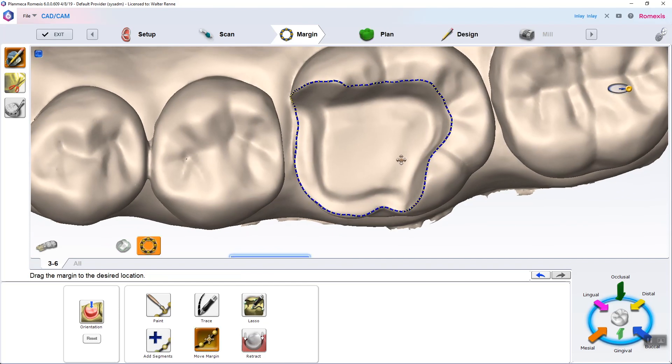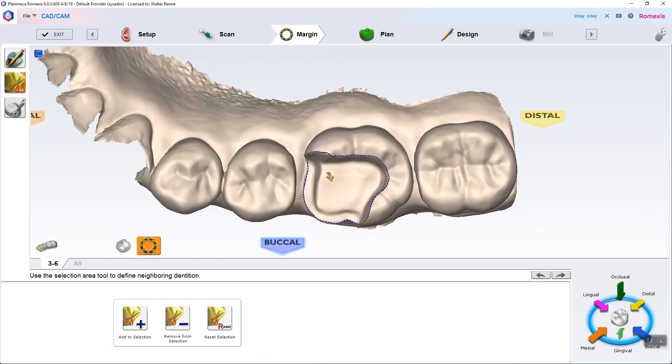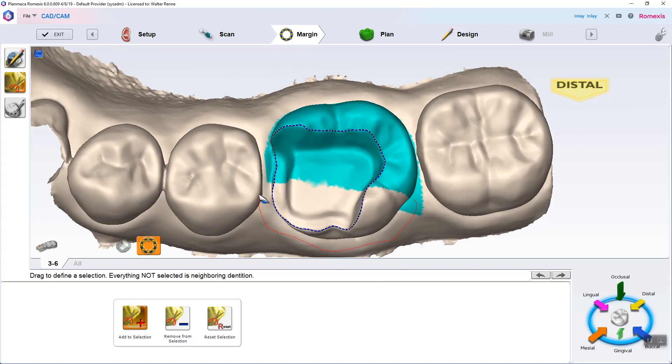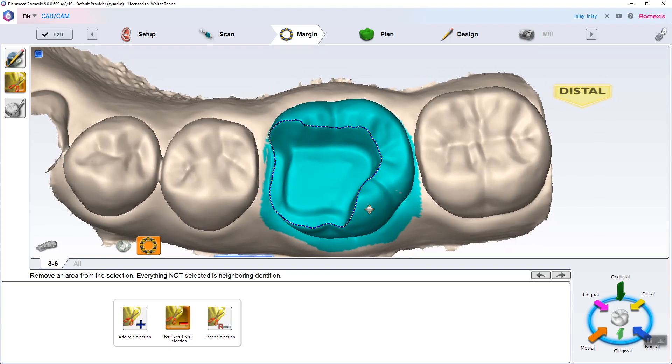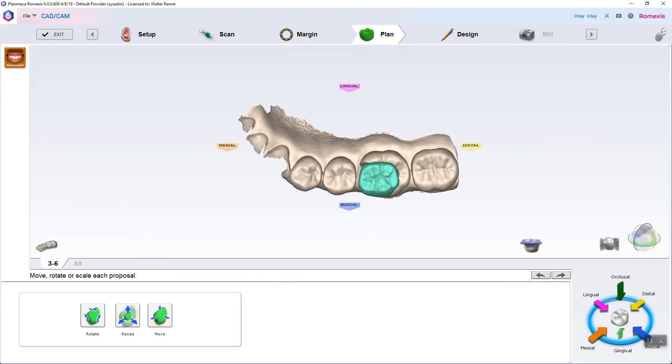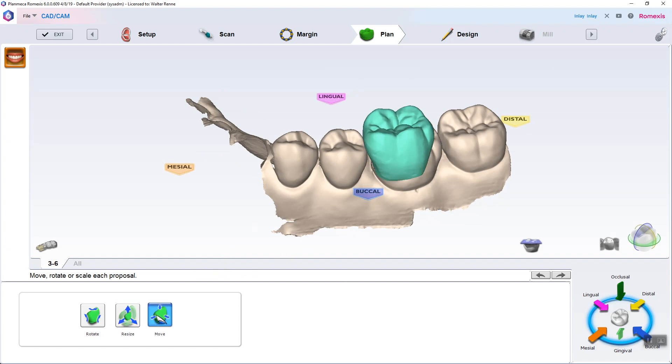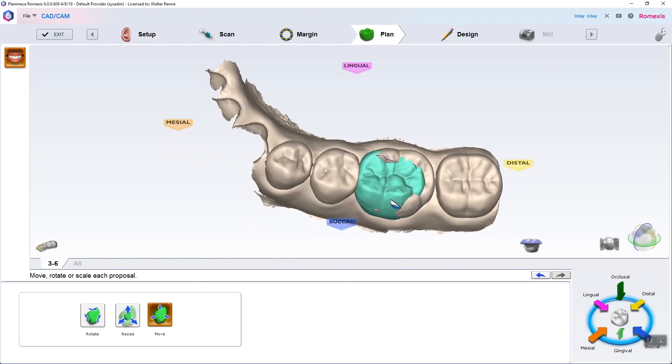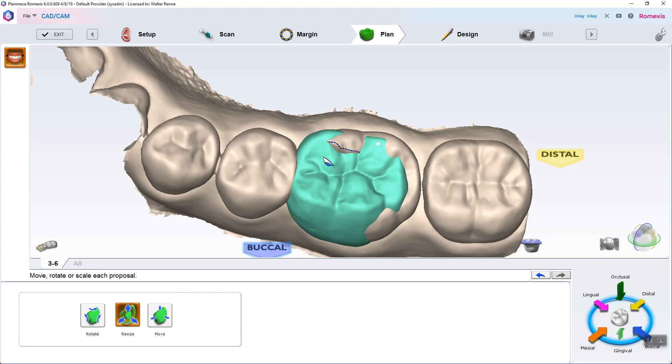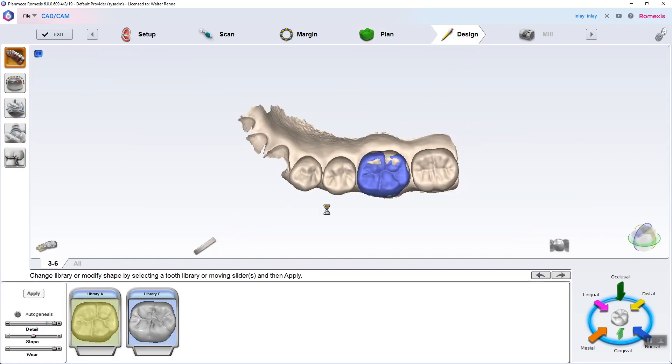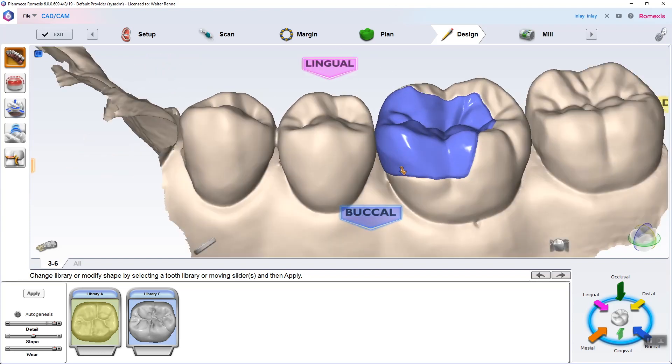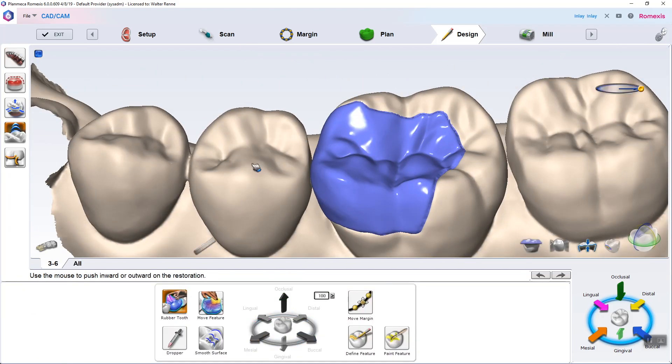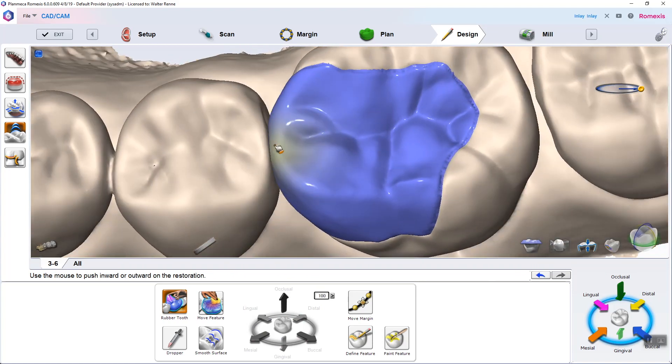Now we're going to try lasso. Lasso works really well for these types of restorations as well. We're going to that extra step, as I showed you in the inlay, where you circle and circumscribe the tooth. Once again, kind of an extra step for inlays and onlays. Then we're off to the plan tab where you use the three tools: basically rotate, resize, and move. And you're going to move that tooth to where it's a match of what you envision the whole entire tooth would look like. Off to design, and you're going to hit apply for autogenesis.